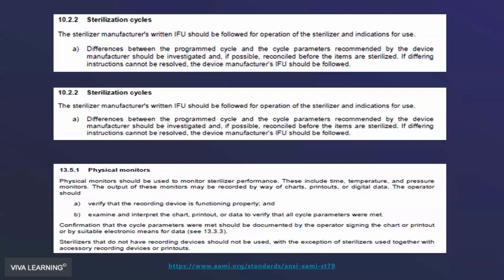But its intended use, its FDA clearance states that it is used for items that are contaminated during a procedure, must be re-sterilized because there aren't replacements for that particular item. And so they are sterilized through that quick unpackaged cycle. And then they are removed and they are cooled in sterile water and put back into use.